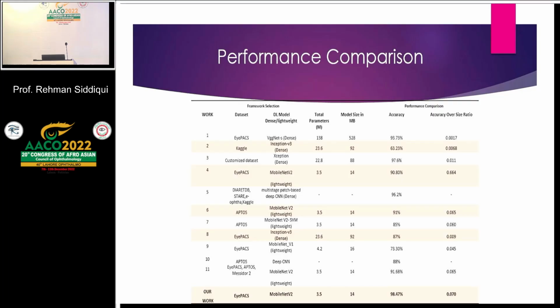In terms of model size, it is 14 megabytes, which is the smallest among all. And at the same time, accuracy is highest.